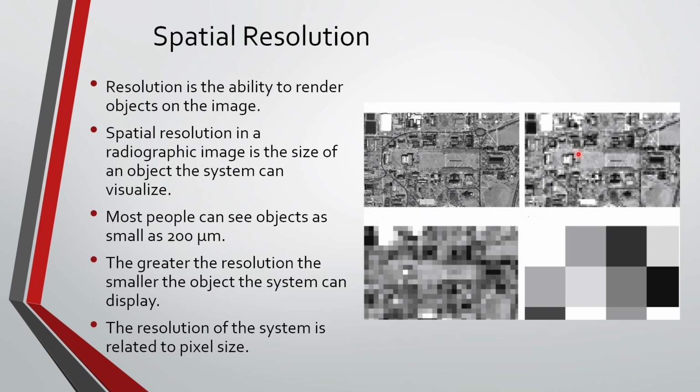In this picture, we have more pixels per inch, so there's more pixels lined up per every inch of this viewing here. So the resolution's better, we would say here. We can start to make out some objects here like this, and this is kind of a line here, and all these structures here, right?